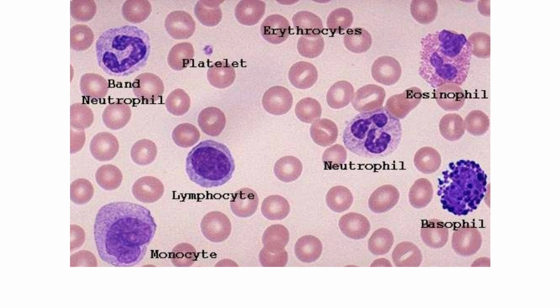Look at this, the cell which is labeled neutrophil. You can tell that it has fine granules, pinkish cytoplasm, and a dark purple to blue segmented nucleus. Now, if you look at the cell just above it, which is eosinophil, it has reddish granules. It is usually bilobed in such a way that it is called bispectacled appearance, as if it has spectacles, but it can be trilobed as well. But the characteristic feature is the granules, which are reddish to orange color.